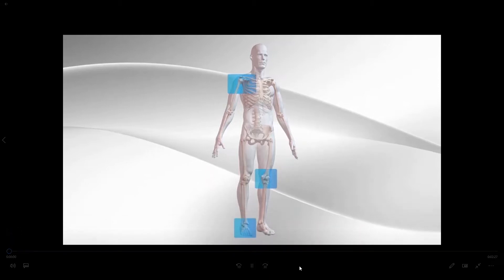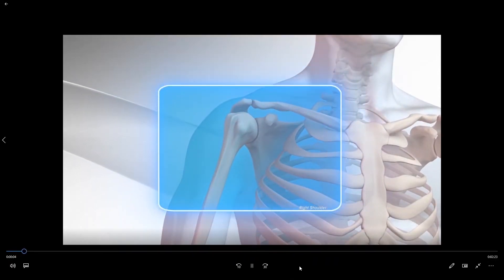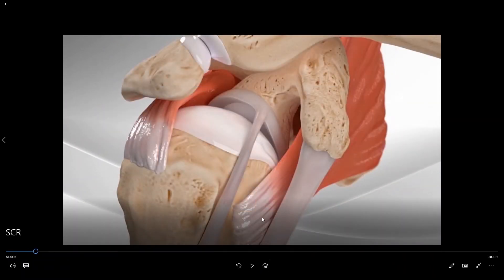We're going to do so by looking at the right shoulder. As we zoom in on the right shoulder we can see that this is the ball of the ball and socket. Here is the socket portion of the ball and socket. Here is your collarbone up above the shoulder and this is a portion of the shoulder blade which goes around to the back.